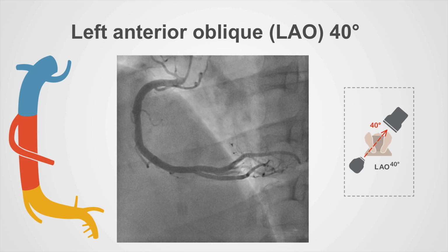Here you can see the frozen frame. Here's the ostium of the right coronary artery. Here's the angiographic catheter. The branch superiorly here is the conus branch, and this small branch, most probably the branch to the sinoatrial node. Here's a small right ventricular marginal branch, and another small acute marginal branch. Here's the distal right coronary artery, and here's where it bifurcates. The most superior vessel is probably the posterior left ventricular branch, and this vessel is the posterior descending artery.